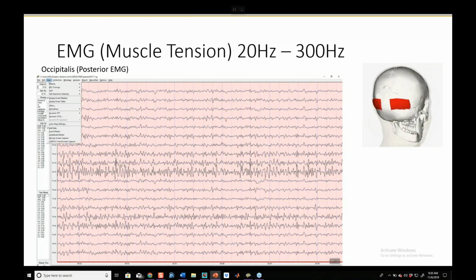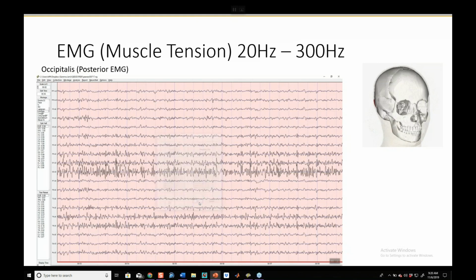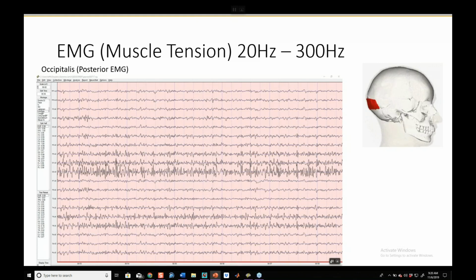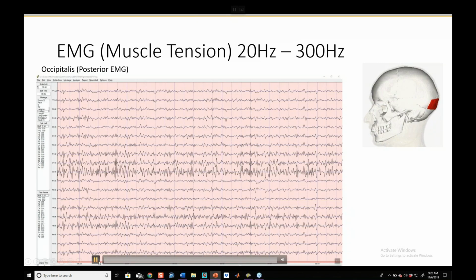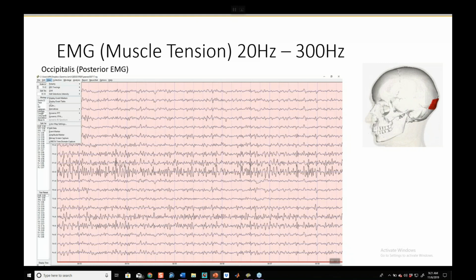So what I'm going to do here is take off the low pass filter. Boom. What I've done there is now I'm allowing everything beyond 40 hertz into the EEG, right? And what that does as a first line of defense is it allows me to say, and I'm going to play this one more time as I complete my description, ooh, we have some beta happening at O1 and O2. It has rounded tops. That's the morphological signature.